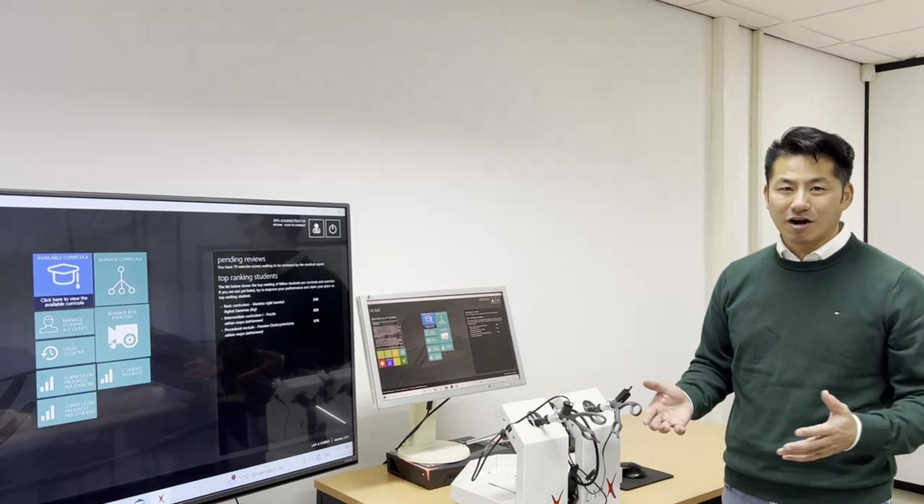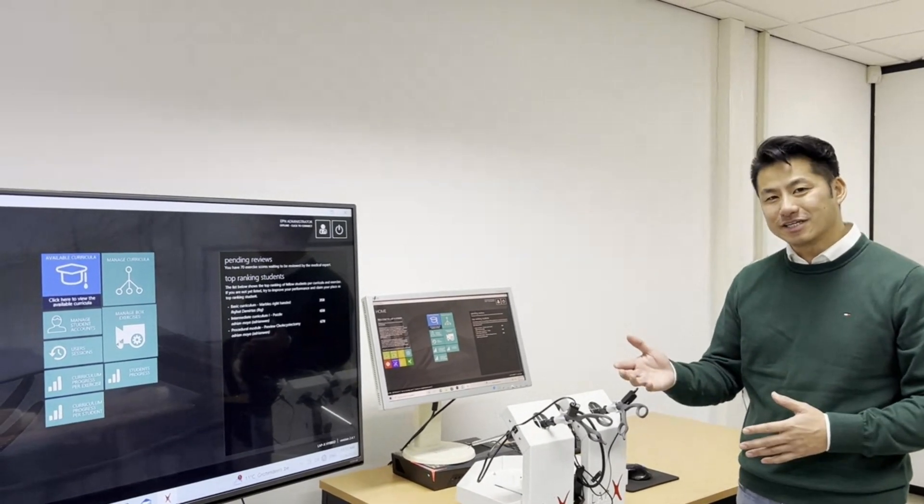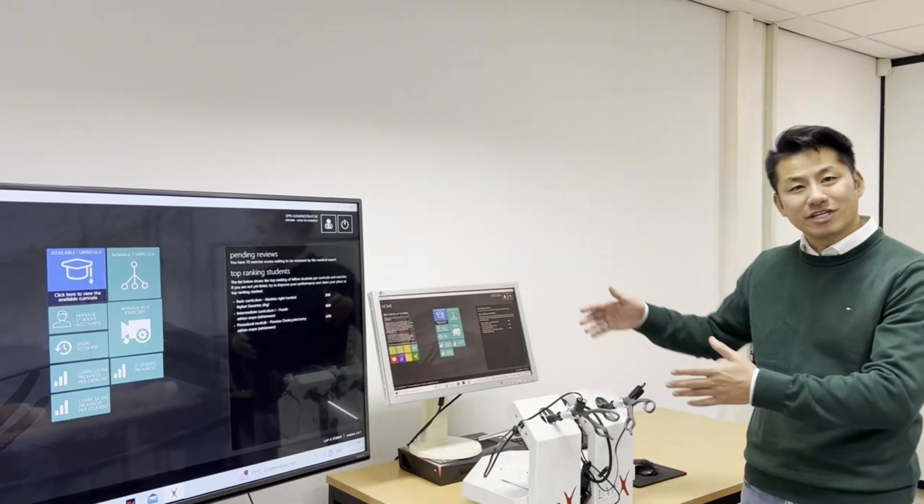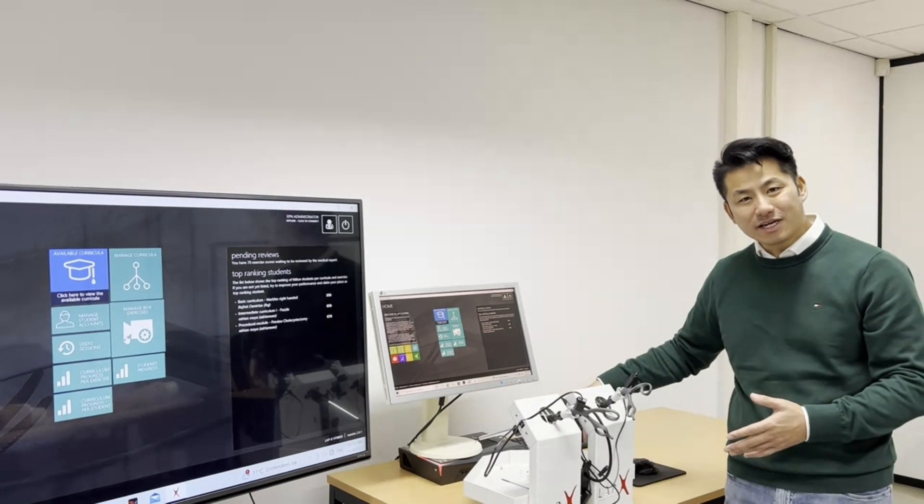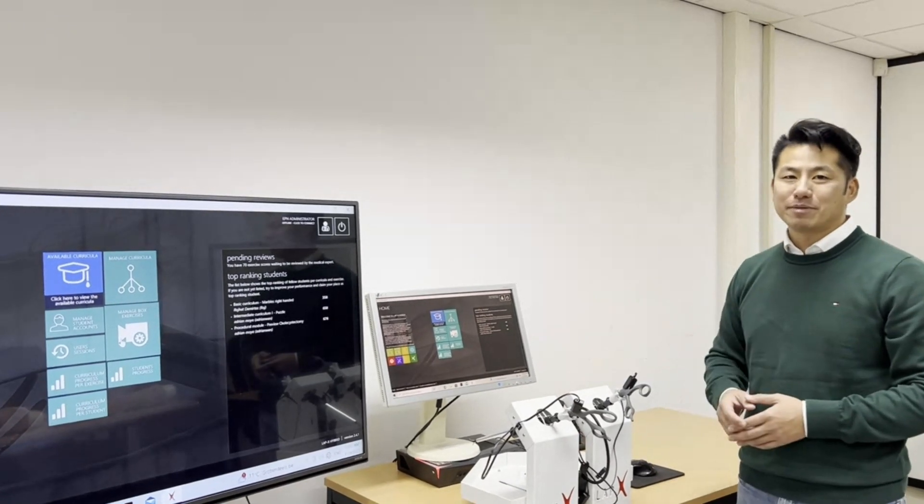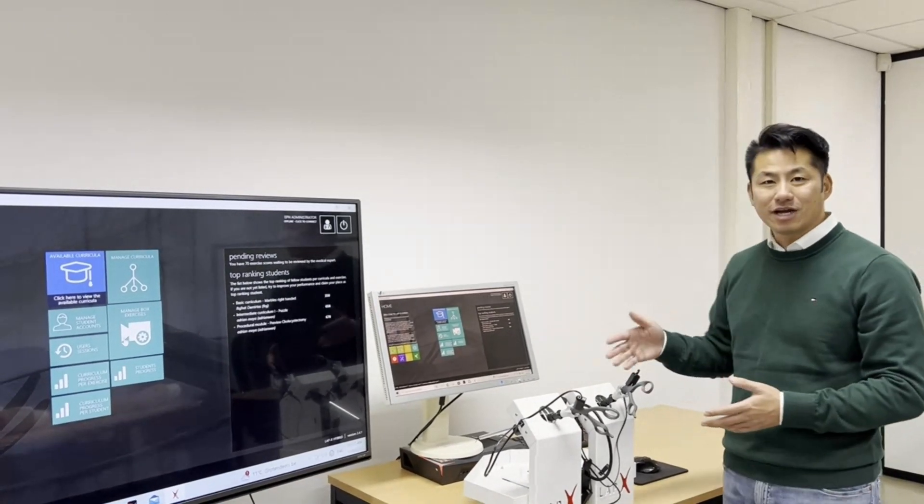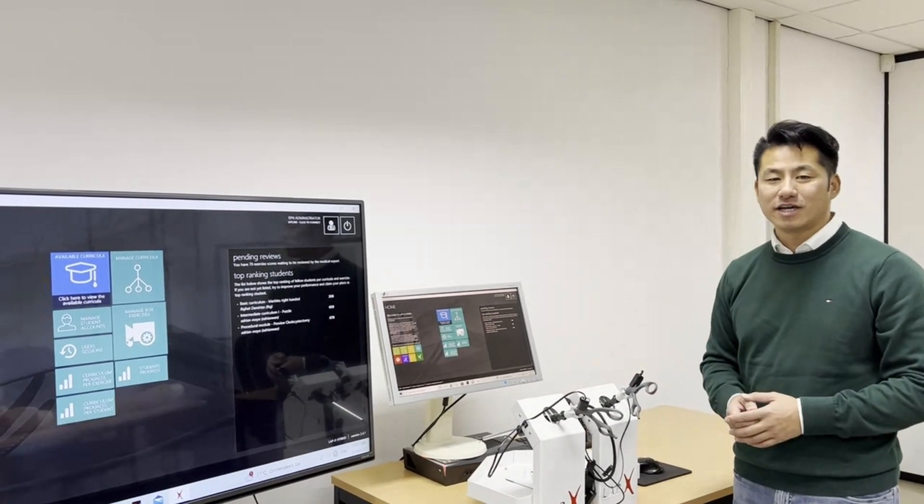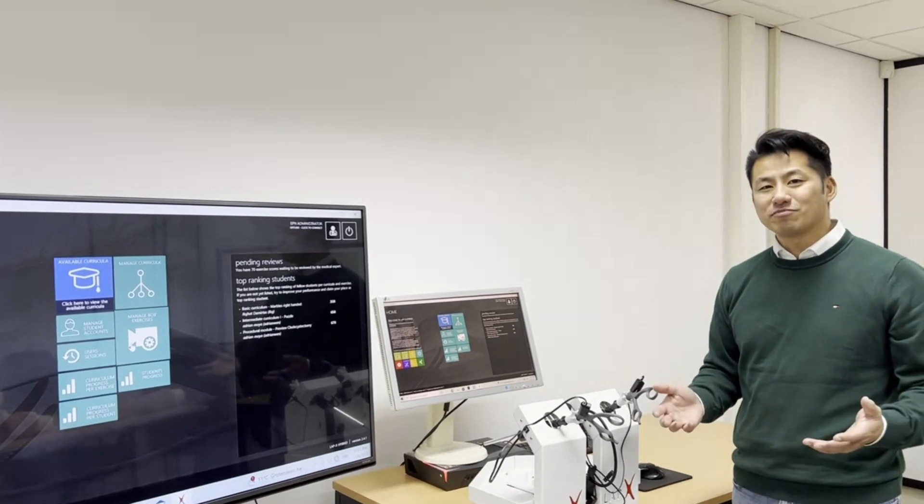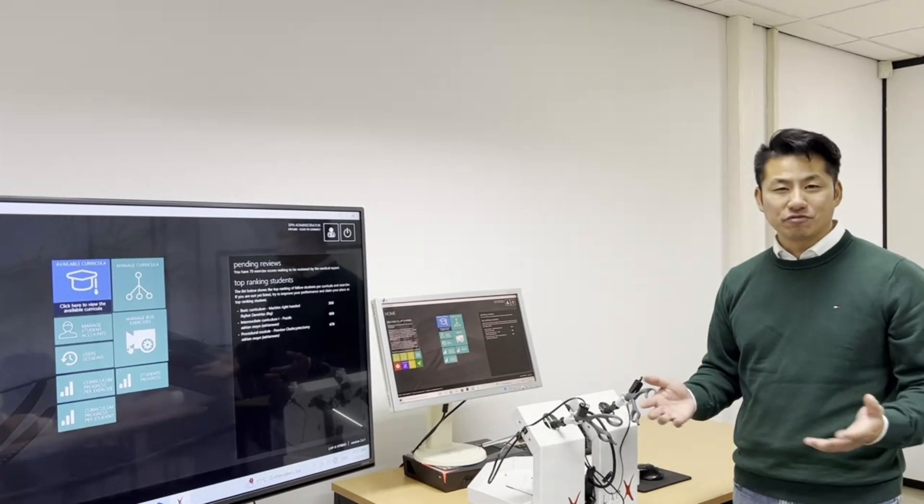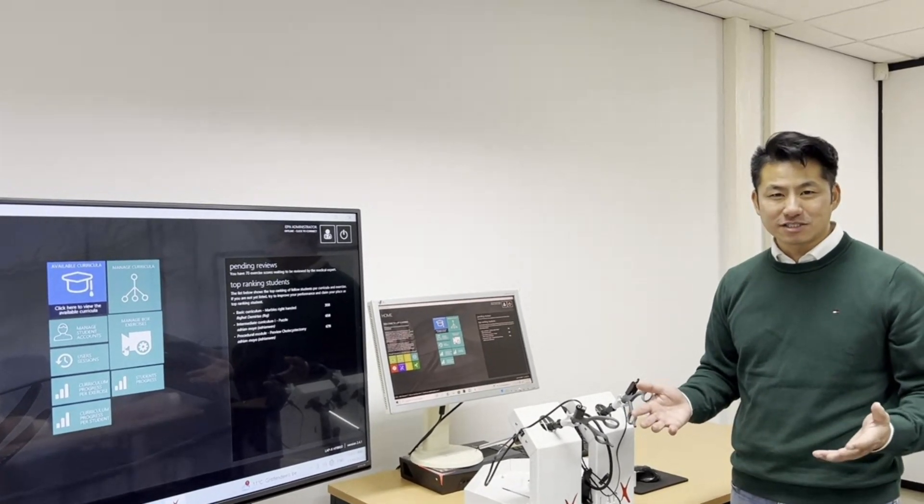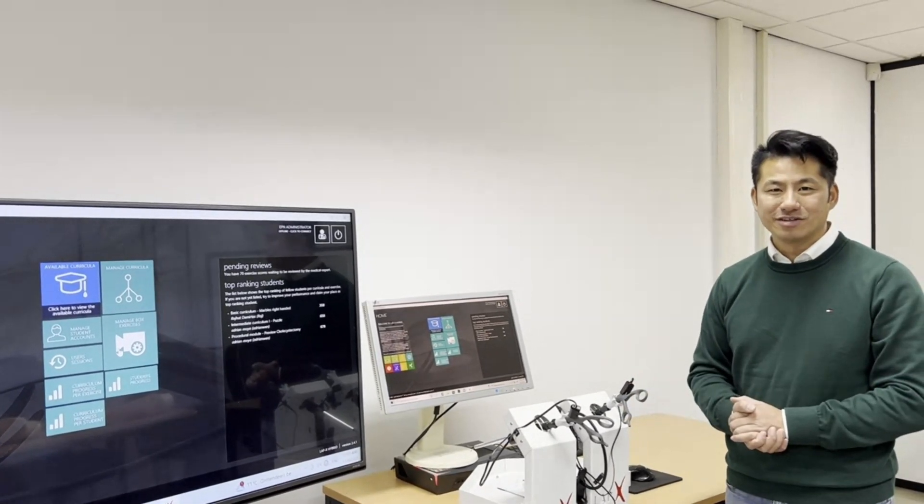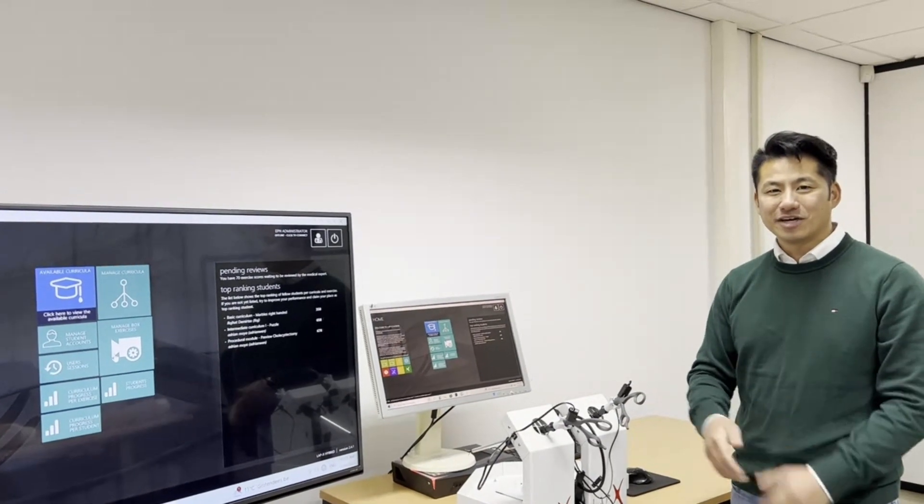Well this is in short how the LabX hybrid works. And the LabX VR is basically the LabX hybrid without the box training. And the LabX box is the LabX hybrid without the VR training. And if you have more questions feel free to contact us and we are gladly to help you. Thank you and goodbye.